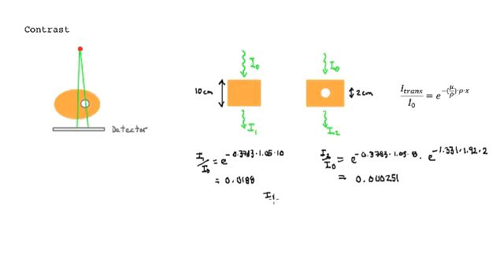All right, so now let me take the ratio of these two. So I1 over I2, and that is actually 74.8. So this then is what we mean by contrast. You can see the number of photons coming out through the muscle is 74 times higher than when you have the bone in place. And so you can see the difference between these two rays coming through. The bone's more attenuating, and so it's some measure of contrast.